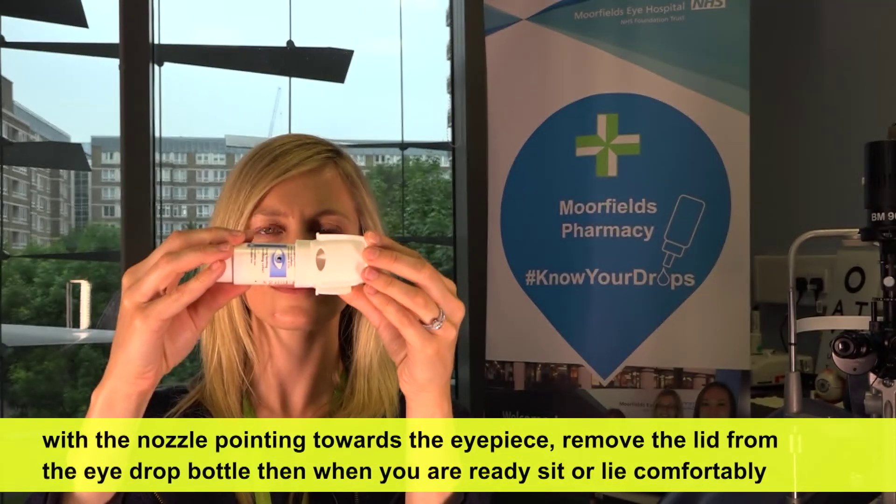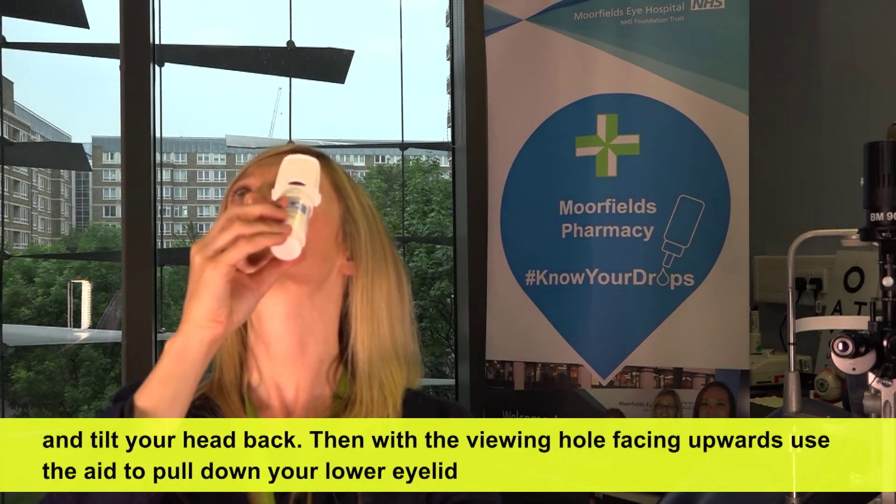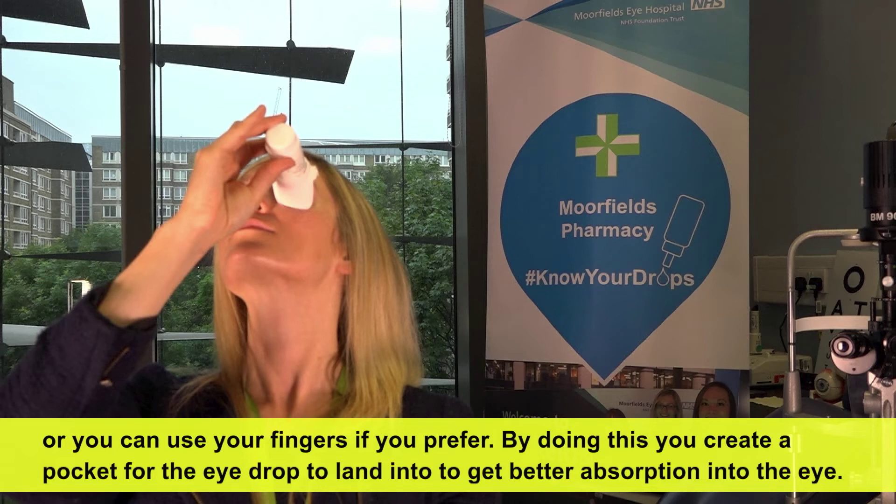Then when you're ready, sit or lie comfortably and tilt your head back. Then with the viewing hole facing upwards, use the aid to pull down your lower eyelid, or you can use your fingers if you prefer. By doing this you create a pocket for the eyedrop to land into, to get better absorption into the eye.